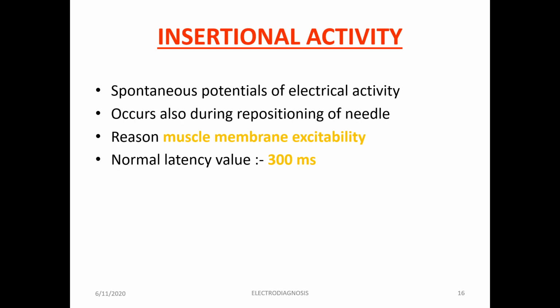Okay, and the reason for this insertional activity is muscle membrane excitability. Because of circulating acetylcholines, you will have excitability of this muscle membrane. Normal value is up to 300 milliseconds.